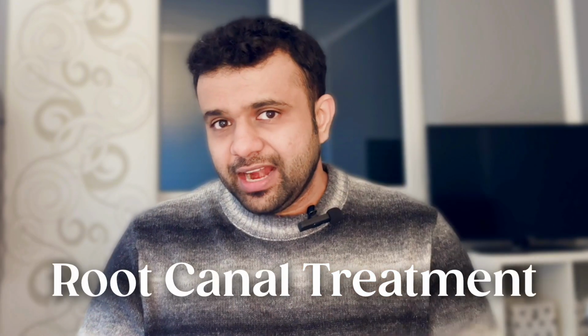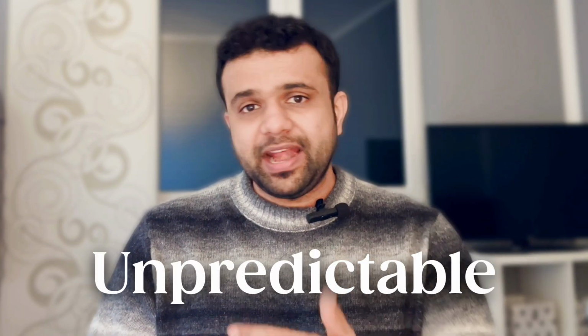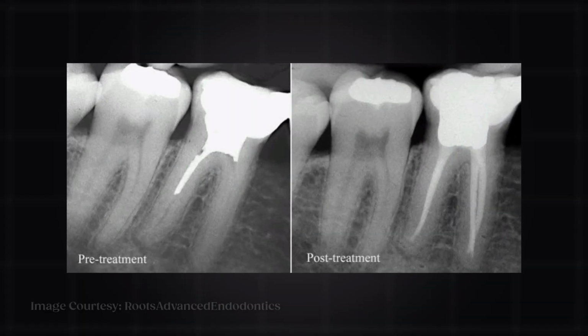Now coming to the second portion of restorative treatment, the root canal treatment. Root canal treatment is always a debatable thing in terms of guarantee, because we all know that root canal treatments are unpredictable. Even if you do a very good root canal treatment, it can still fail, or you do a bad root canal and it can last for years. Still, insurance companies have one standard protocol: you are liable to take pre- and post-operative X-rays. In your post-operative X-rays, your gutta percha fill should be up to the apex or 1 millimeter from the apex. That is the condition for a successful root canal treatment.